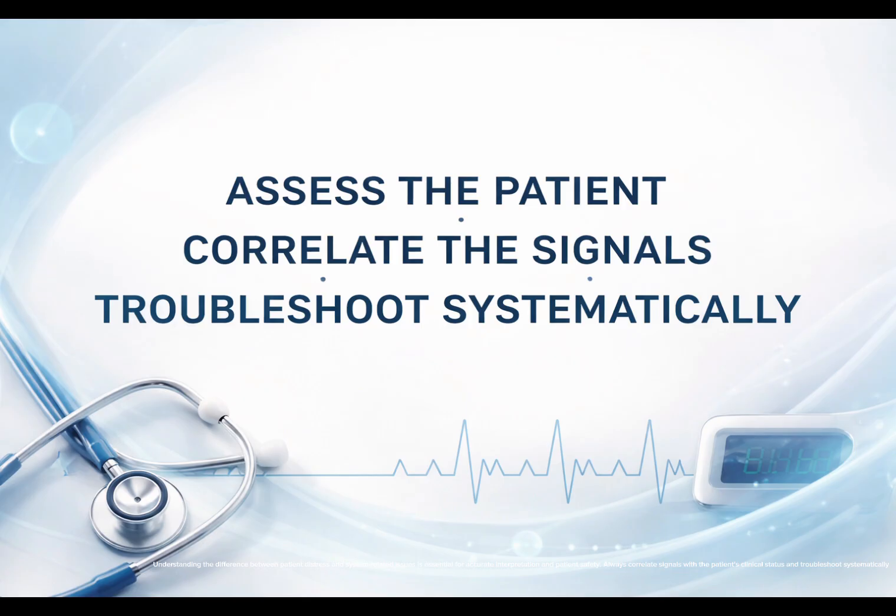Understanding the difference between patient distress and system-related issues is essential for accurate interpretation and patient safety. Always correlate signals with the patient's clinical status and troubleshoot systematically.